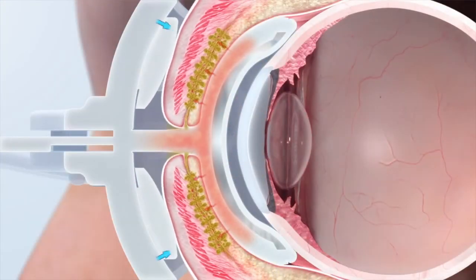This bacteria does have a small chance of entering the eye in an open eye surgery like cataract surgery, which could contribute to an infection. So by doing this gentle cleaning prior to surgery, it helps promote less dry eye, and then it improves the safety of surgery.